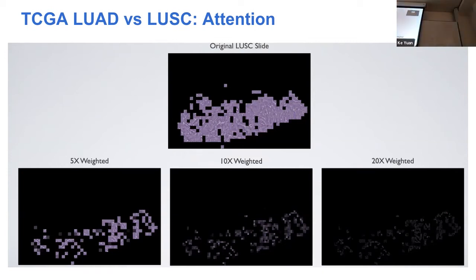We use the representation that we have, and then we feed it into a sigmoid type layer, and you use that to compute the weight of each tile based on its representation. So basically, a CNN that had been trained with the sigmoid function.